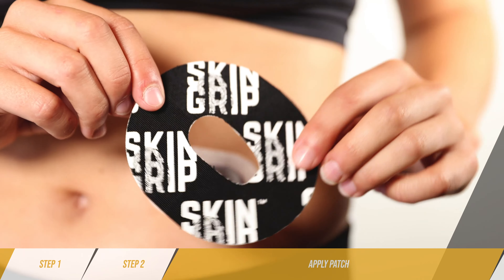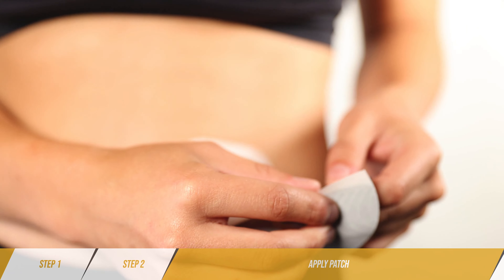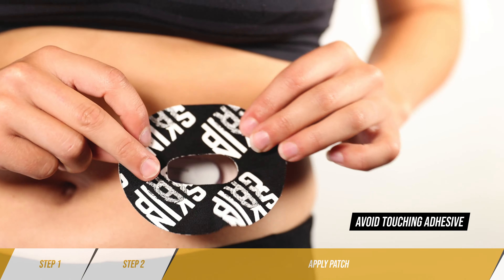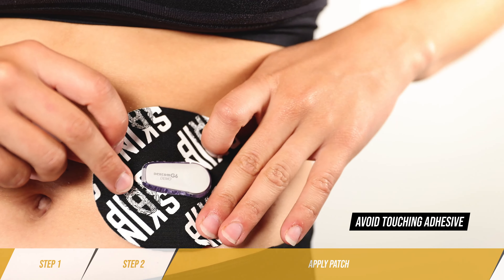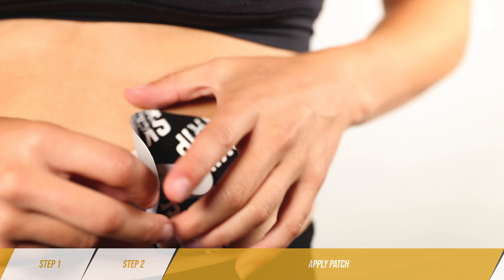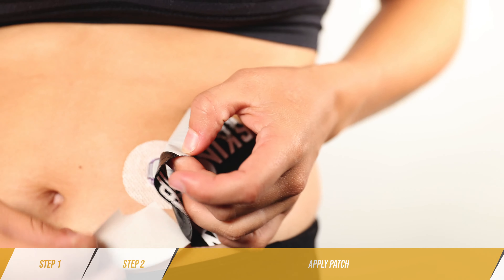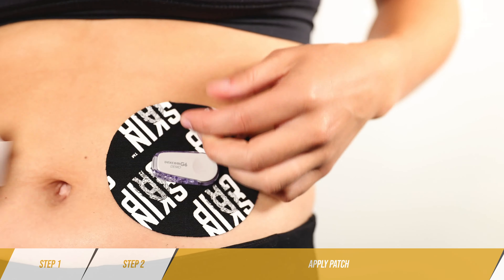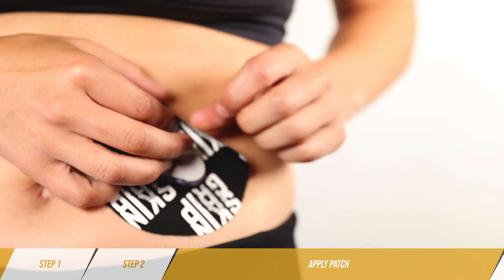Step 3: Apply Patch. Peel and place one tab at a time. Having trouble on your own? Get some help or apply in an easy to reach location. Firmly press the patch to the skin and remove any wrinkles.